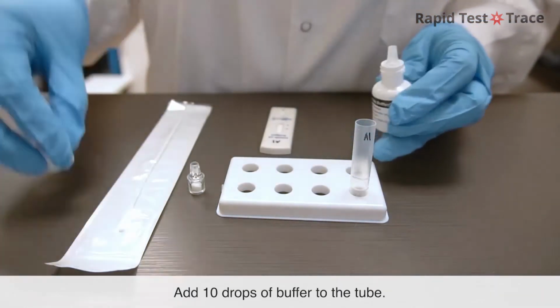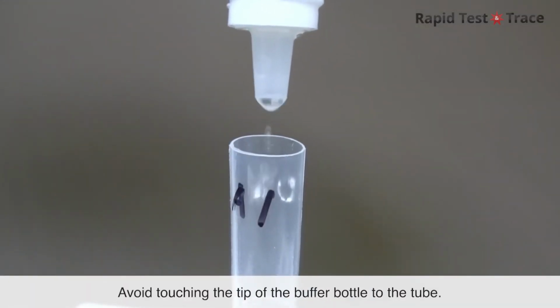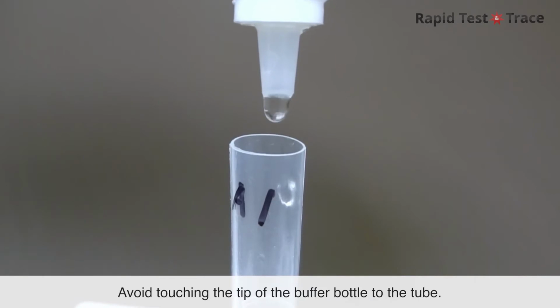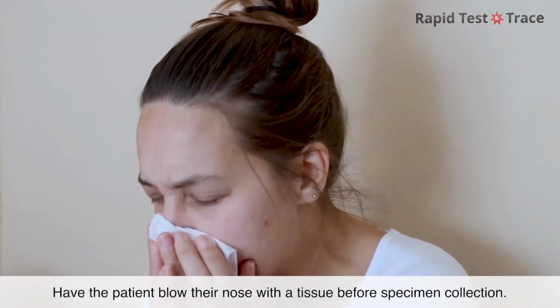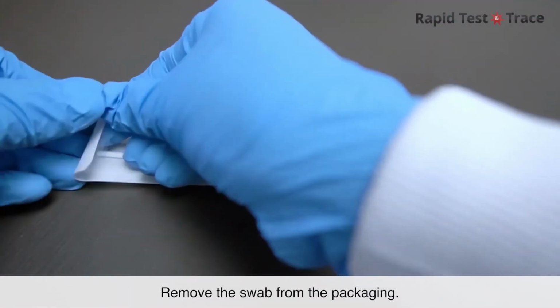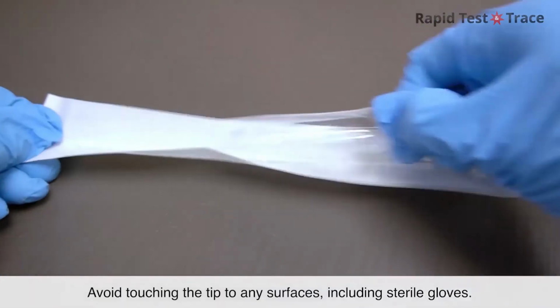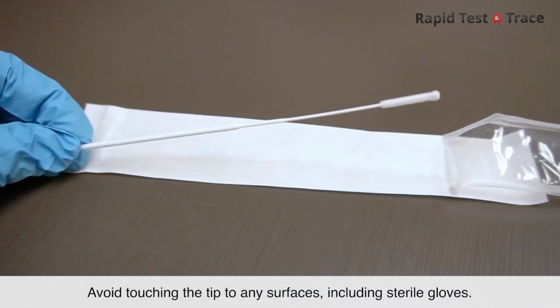Gently mix the extraction buffer. Add 10 drops of buffer to the tube. Avoid touching the tip of the buffer bottle to the tube. Have the patient blow their nose with a tissue before specimen collection. Remove the swab from the packaging. Avoid touching the tip to any surfaces, including sterile gloves.